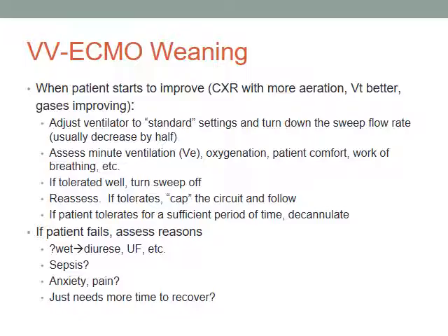And if they keep doing fine, we do what's called capping the circuit, where we make sure there's absolutely no chance of any air getting into the circuit and see how they do. And if they do fine, they don't need ECMO anymore. You can get them off of it. Typically, we'll watch them for about a day before we remove ECMO. It's such a big deal to put the patient on. I really don't want to take it out one afternoon and put it back in that night. It's like bad form.